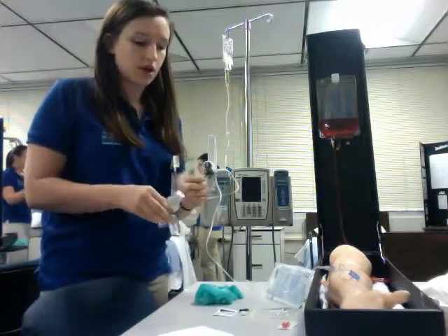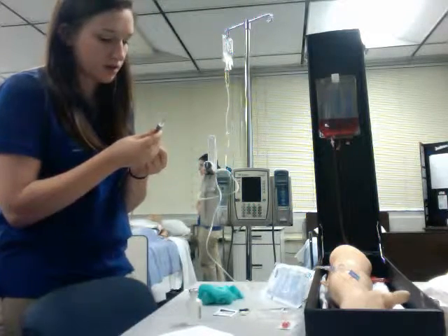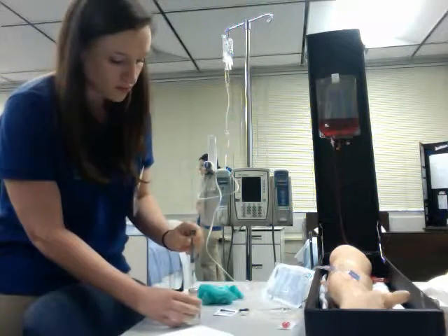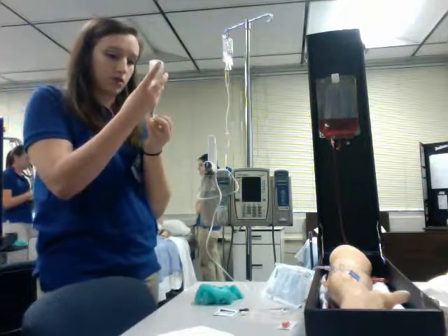So I'm going to clean off the top. I'm going to draw up half a milliliter of air. I'm going to label the tubing with the date, the time, and my initials. Draw back half a milliliter of Flagyl.